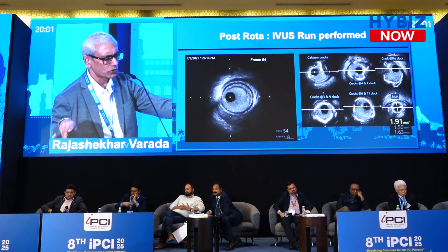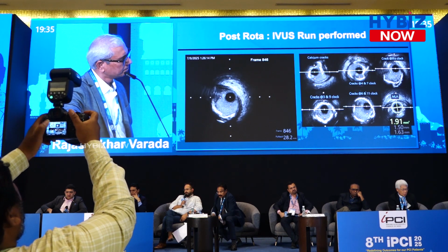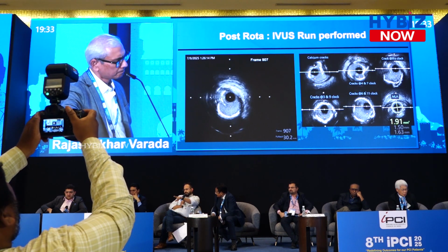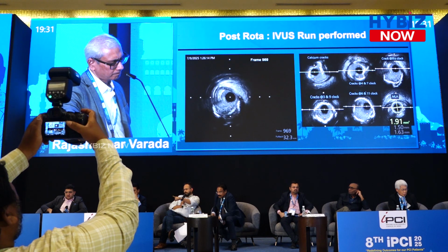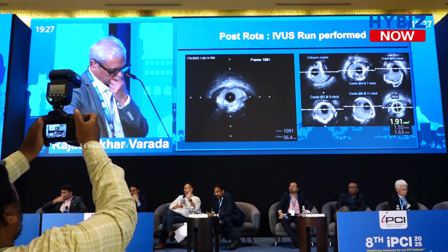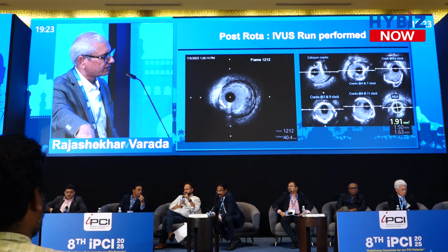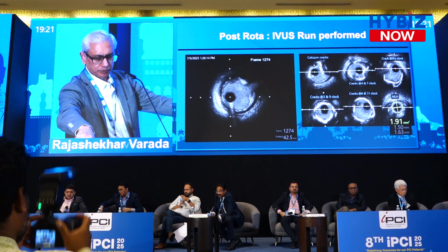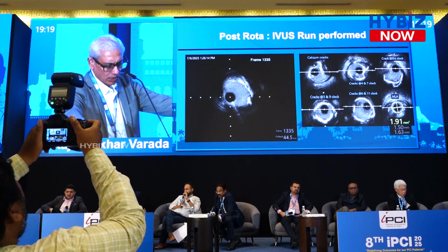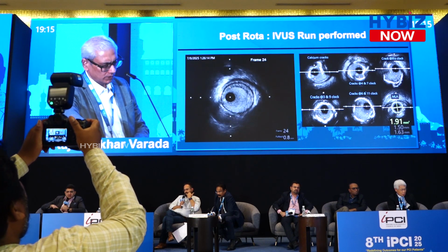But this is a post-rota IVUS. You see, if you ask me, except for the third image, rota hasn't touched the calcium in any of the segments. There are multiple cracks, actually, at multiple levels. The only thing I can see is a reverberation around the catheter. There is a place where rota has touched the calcium. I don't think rota has done anything.